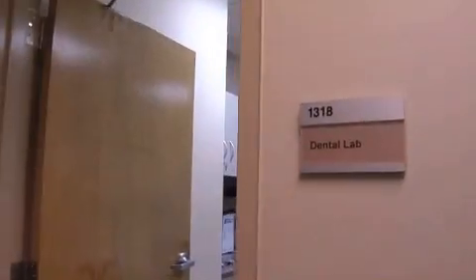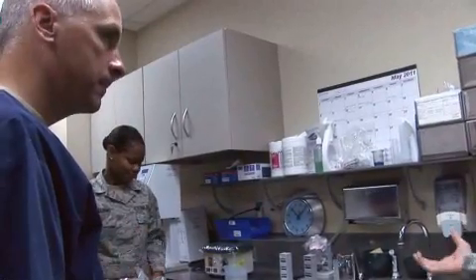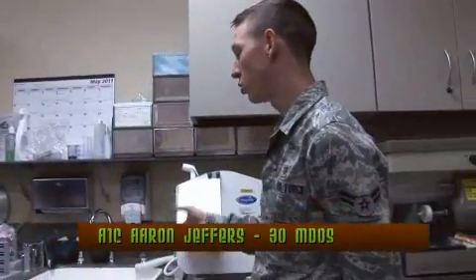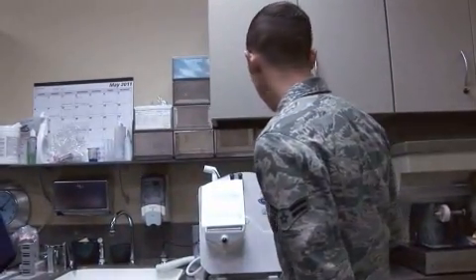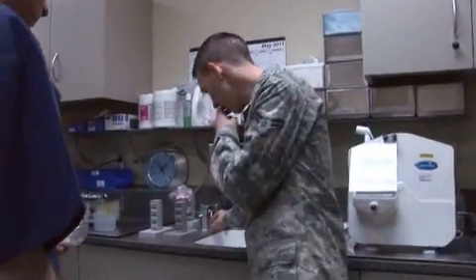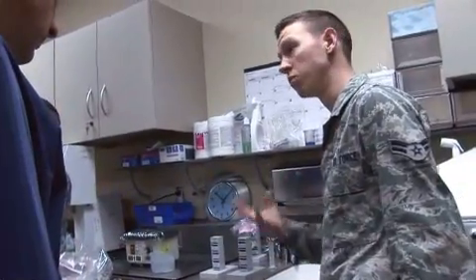Good morning, Lab. How are you doing today? We're going to mix it up for y'all and have y'all pour your own impressions. The initial set — the entire set takes about 24 hours. You can work on it within about 20 to 30 minutes. For a sports guard it's a little bit easier; on other cases we might wait a little bit longer. We're going to be using some slurry water, which is going to speed up the initial set.